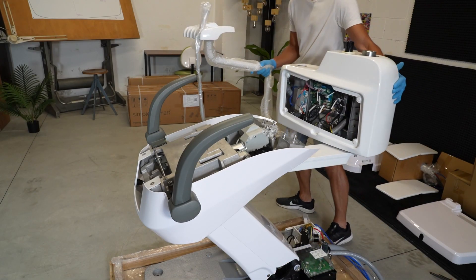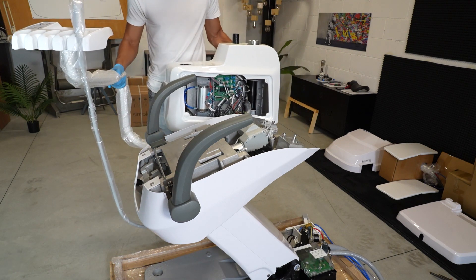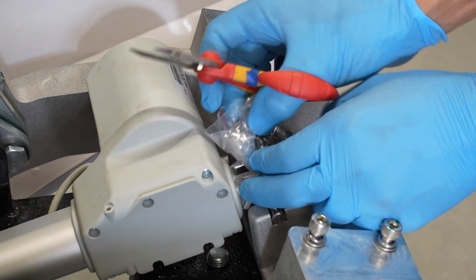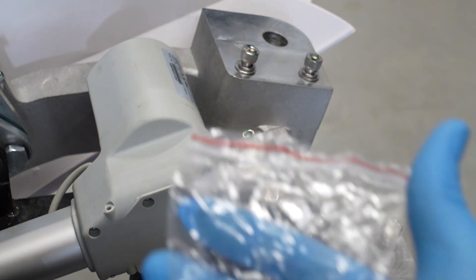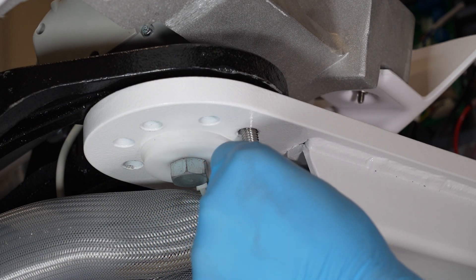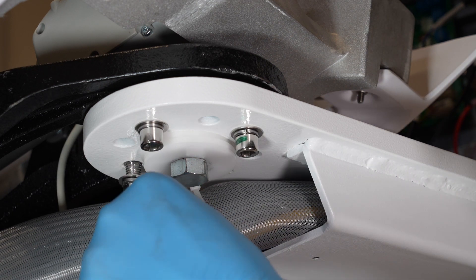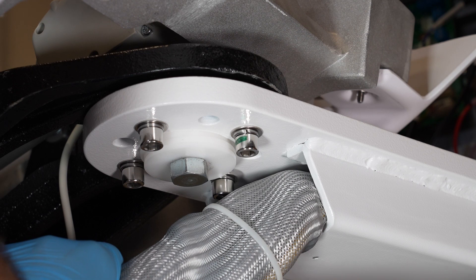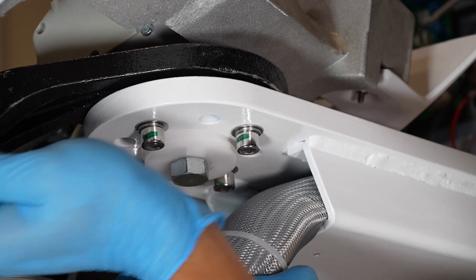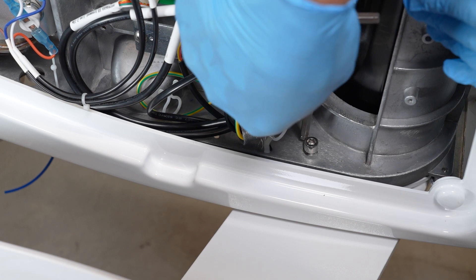Turn the water unit. Fix the water unit arm in the right position. Remove the screw fixing the water unit.